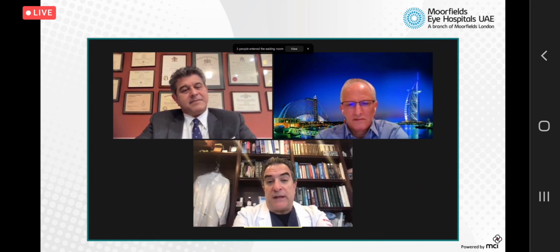Now, if you are able to see these bullous keratopathy patients earlier in the course of their disease, for example, the patient is referred to you after cataract surgery with corneal edema. You give it 1, 2, 3 months. It doesn't clear. Now, those are great for DMEK. I always peel off the epithelium. It makes it much easier to visualize. I use glycerin to deturgesce the cornea. I also use the glycerin in my office for that purpose. So there are ways to clear your view. Most effective is removing the epithelium.